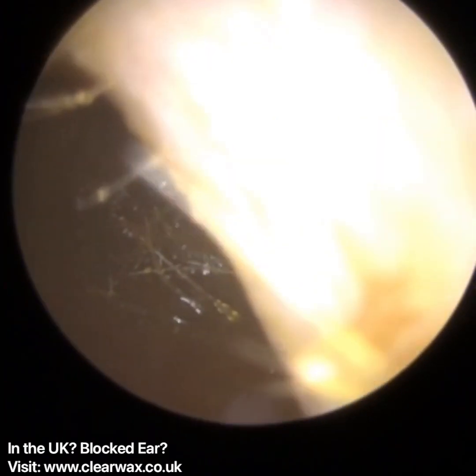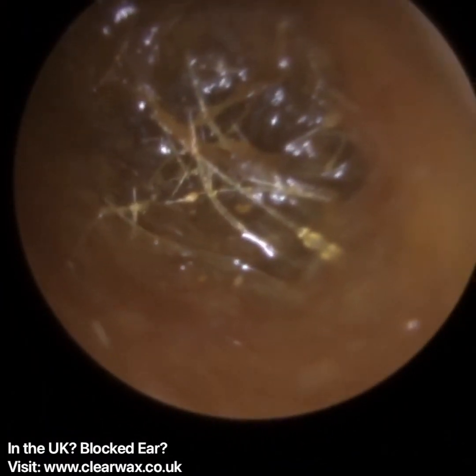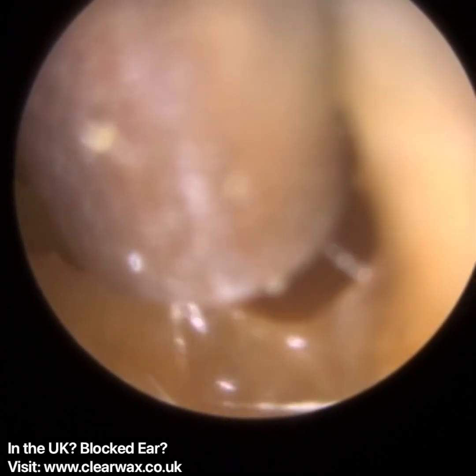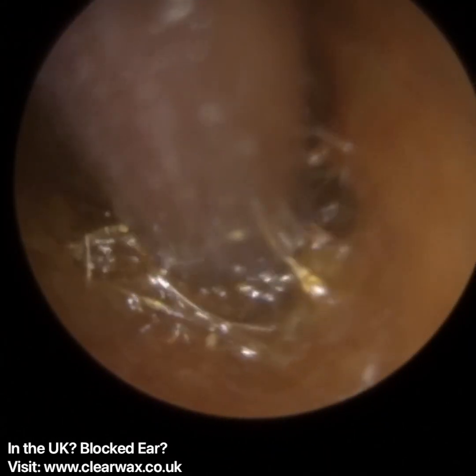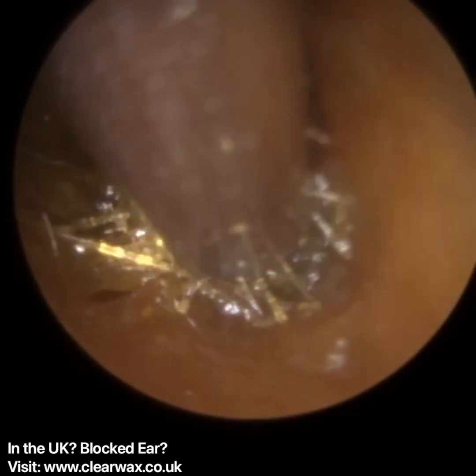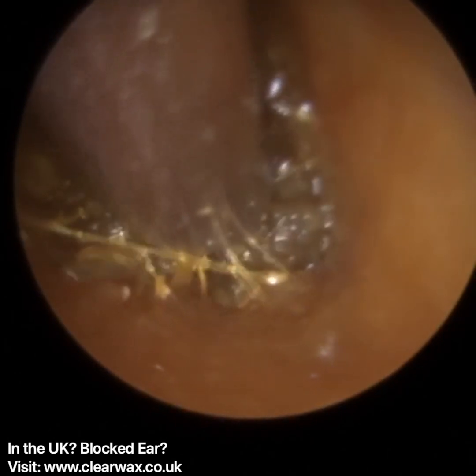Now, the patient themselves reported the left ear being the worst one out of the two. The right one was a bit more impacted, it was a bit more mushy, so I think they put a bit more drops in here, and you can just see that consistency. I was just trying to explain the consistency, and sometimes when patients ask me, there's nothing else I can think of other than it's like a diarrhea consistency.